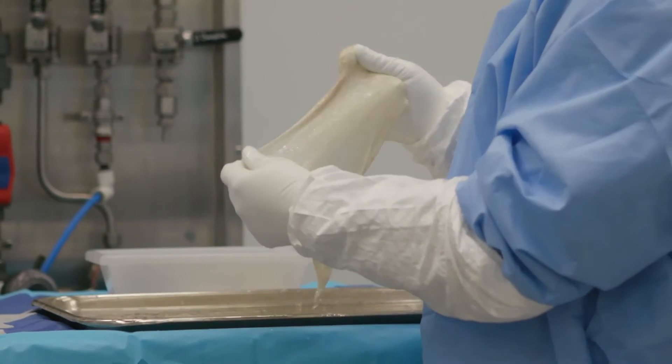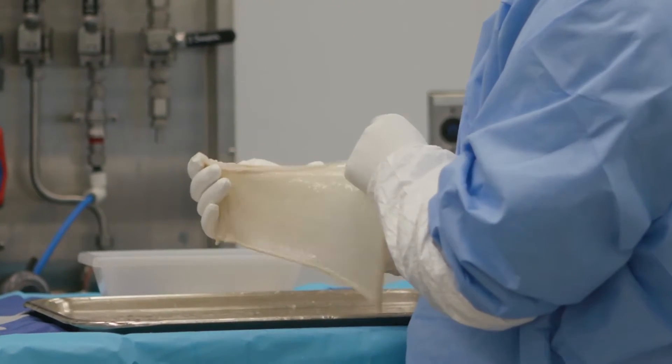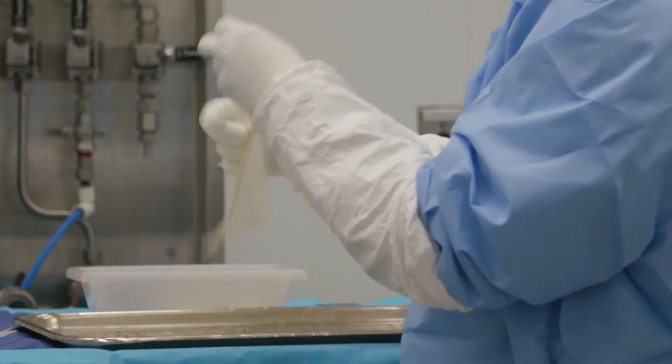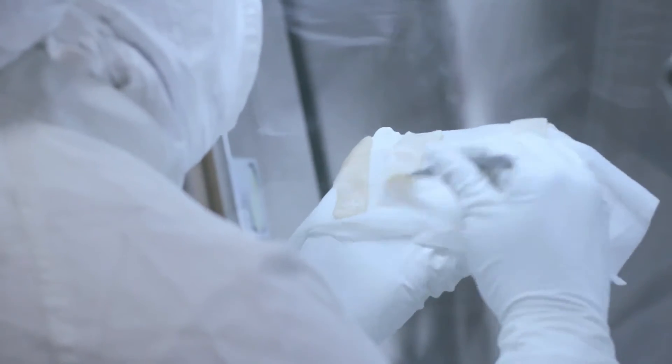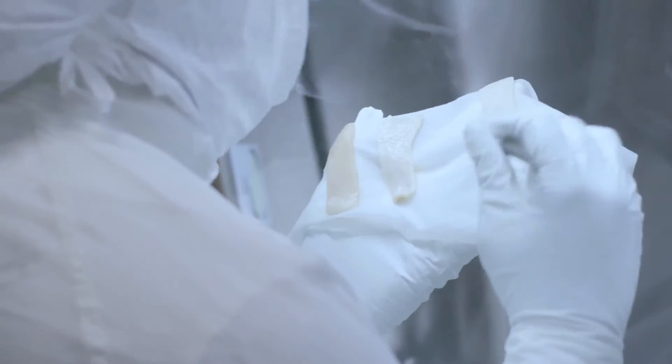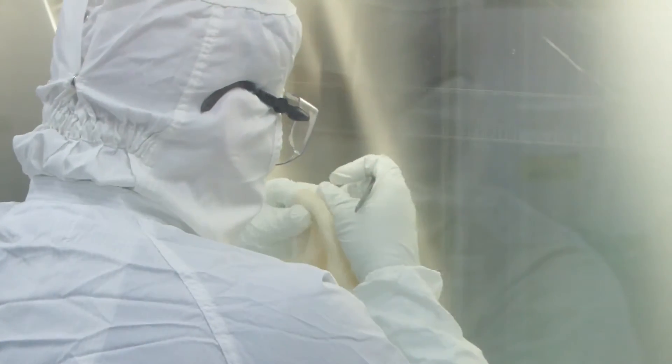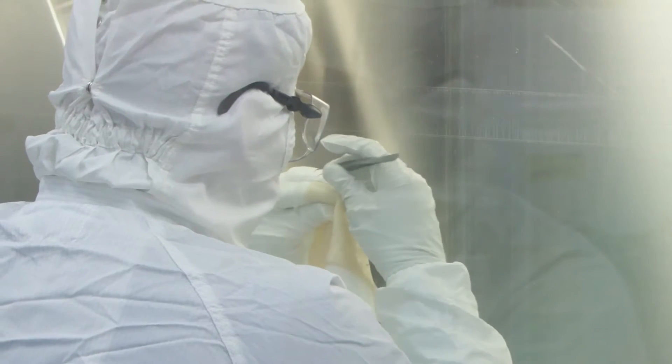The tissue is now ready to be cut into its final shape using a specialized die cutting technique. Final visual inspection is performed on every piece to ensure it meets our high quality standards. For instance, any remaining hair is manually removed at this stage.